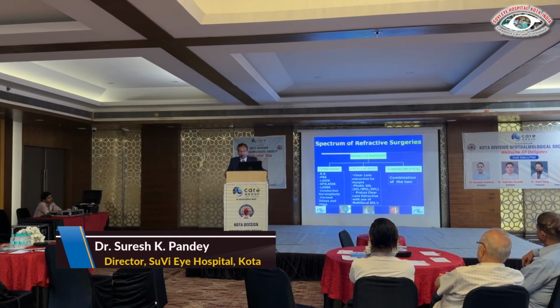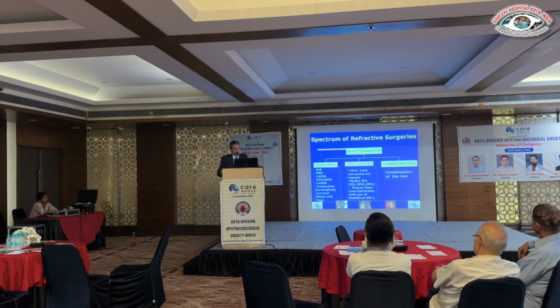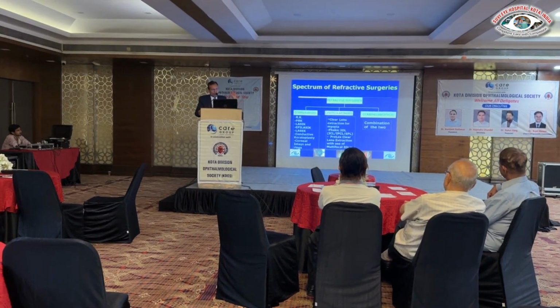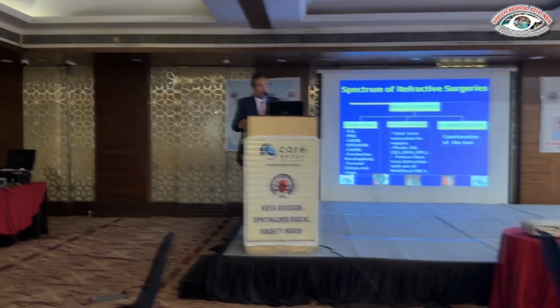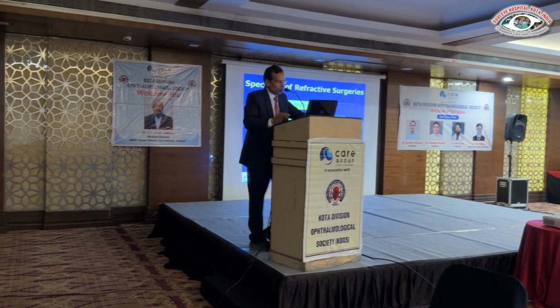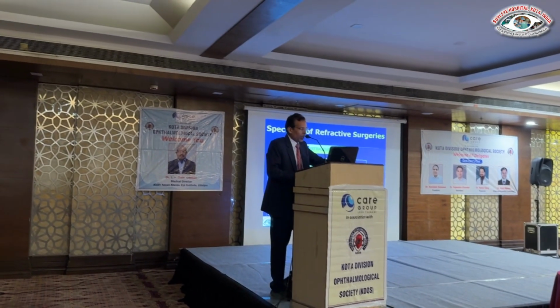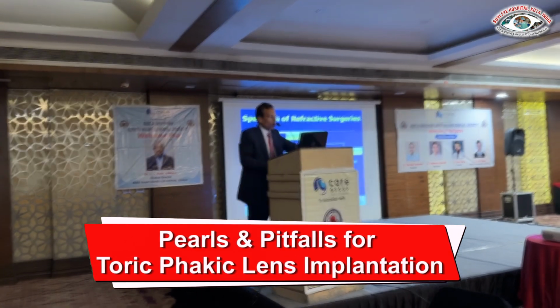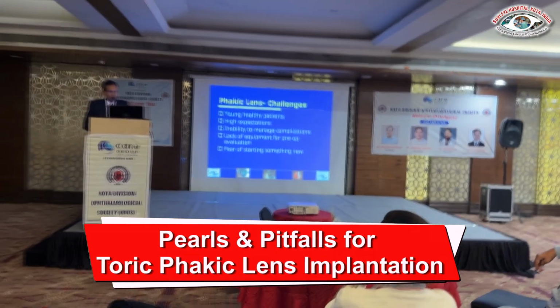rings. And then comes the era of lenticular-based refractive surgery, which includes clear lens extraction, what is known as refractive lens exchange, and the Phakic lens remains one of the most important aspects of the correction of high myopia. There are different types of Phakic lens, anterior chamber Phakic lens and posterior chamber Phakic lens, but now we are mostly using the posterior chamber Phakic lens. And then the technique of bioptics, which includes the combination of refractive surgery, LASIK, and the Phakic lens.